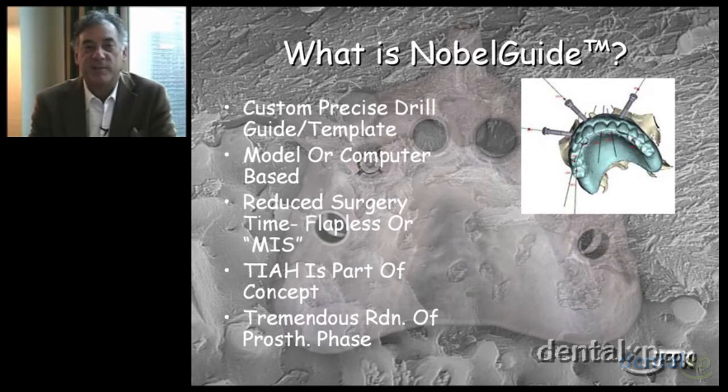It takes it to the next step where the prosthesis is created at the time prior to the surgical events, and a partner laboratory that will work with the milling titanium will get a framework that's precise to fit on top of the pre-planned implants. This alone is a huge reduction in the prosthetic phase of the case.